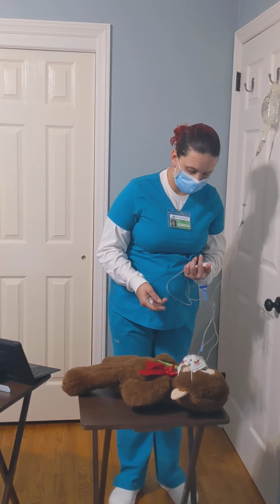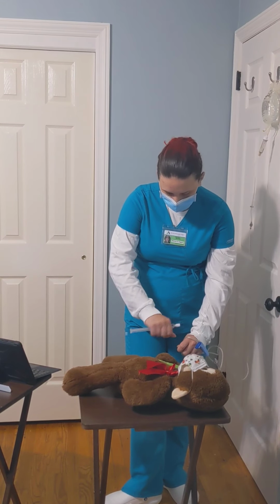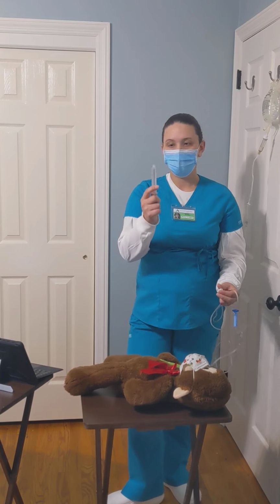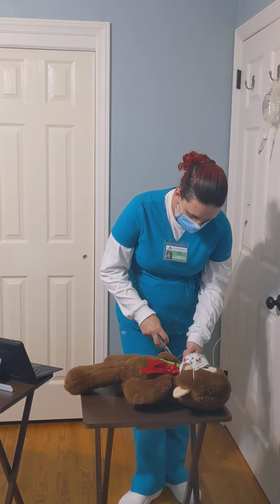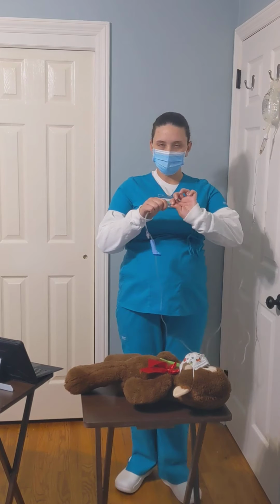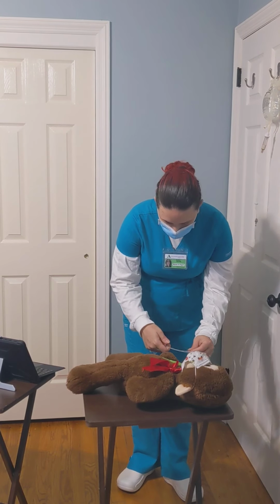Okay, so I'm going to remove the disinfected cap, but I'm also going to scrub her hub with alcohol. Going to get any bubbles out of our flush. We're going to flush her line. And maintaining sterility of this cap, we're going to connect it to our IV site.